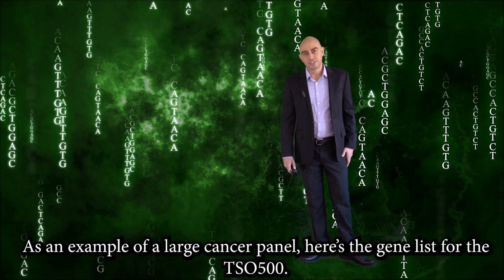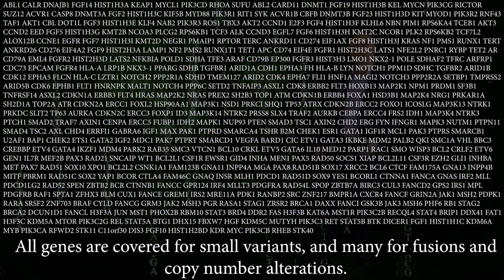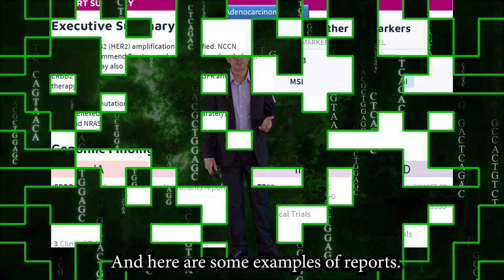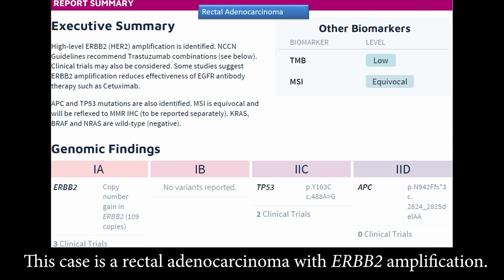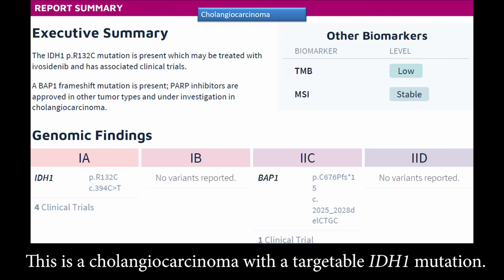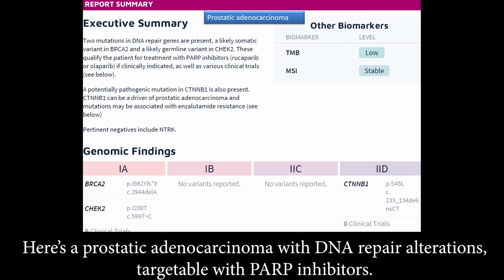As an example of a large cancer panel, here's the gene list for the TSO 500. All genes are covered for small variants and many for fusions and copy number alterations. And here are some examples of reports. This case is a rectal adenocarcinoma with ERBB2 amplification. This is a cholangiocarcinoma with a targetable IDH1 mutation. Here's a prostatic adenocarcinoma with DNA repair alterations, targetable with PARP inhibitors.